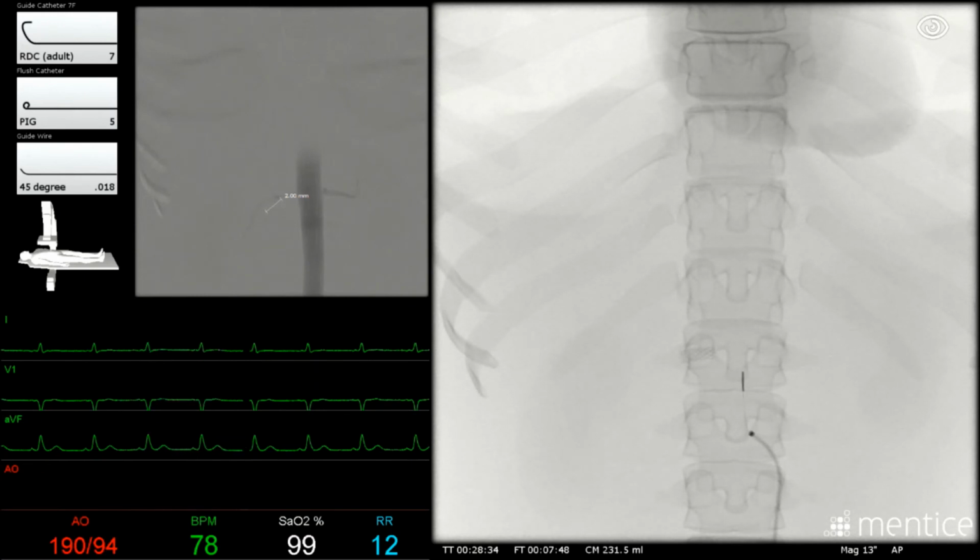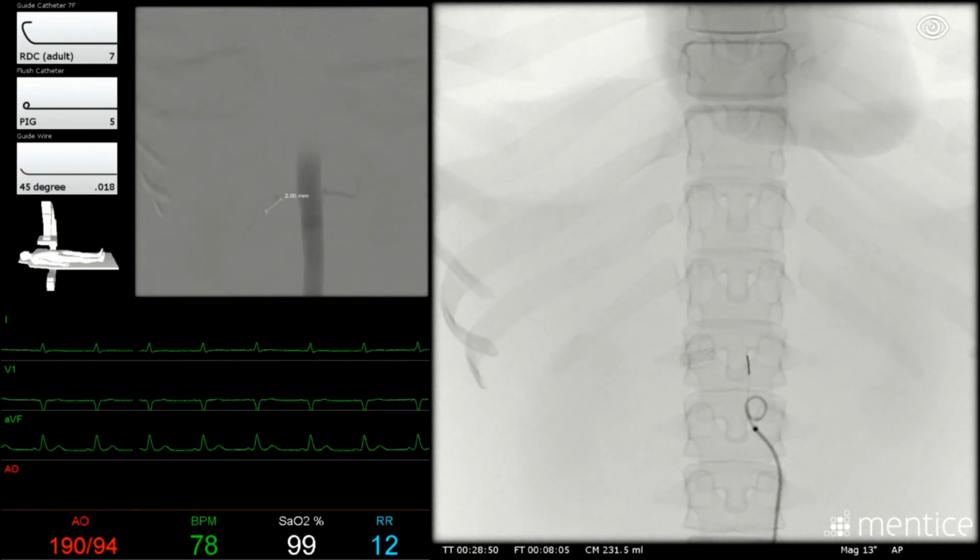As I struggle with my tools here, I'll take this opportunity to tell you the physical tools I used in the simulator for this procedure. I used an 035 guide wire and an 018 guide wire for my wires. I used the same 5 French catheter for the pigtail, cobra, dilation and stent catheters, and I used an 8 French catheter for the guiding catheter. You can really use any real-life device in the machine so long as it has a straight tip, so you can simply clip off any curved tips and use them in the machine.